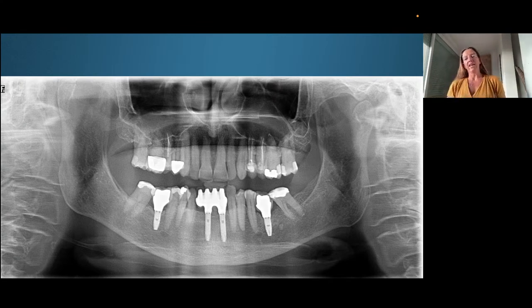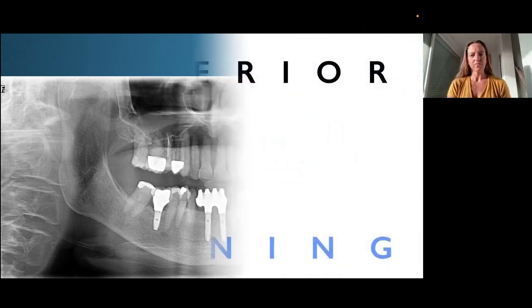So again, mesial-distal space first. Second, amount of bone that you have, where do you have the best bone available, okay? And emergence profile of your teeth. So you have to take these 3 into consideration in order to understand where you're going to plan your 2 implants when you're going to substitute the 4 incisives.